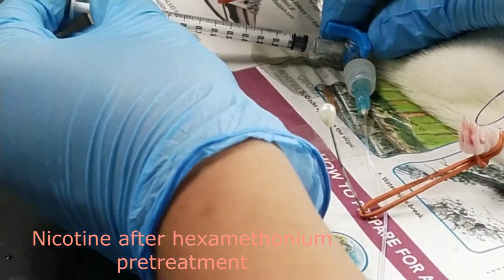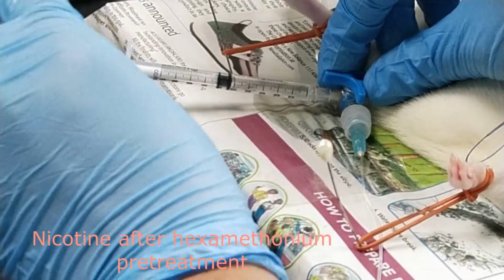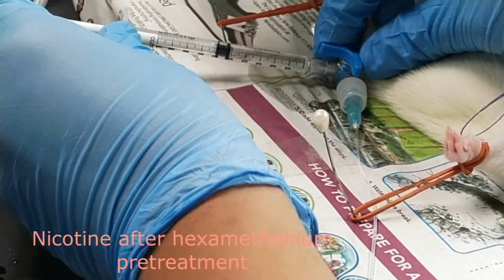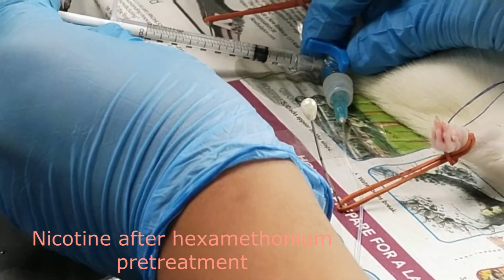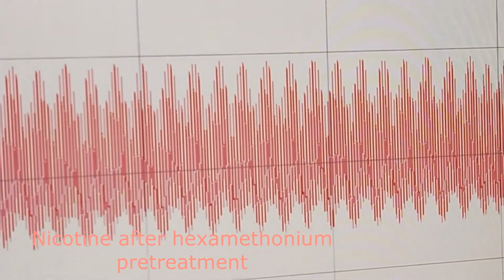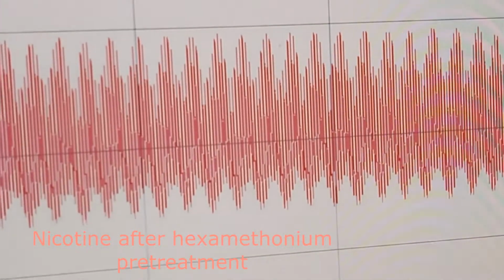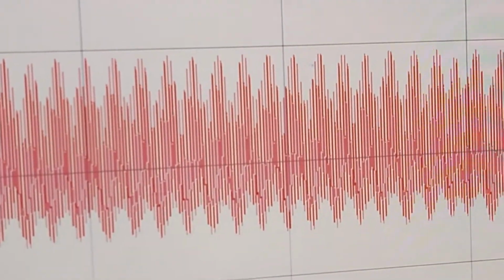Okay, so followed by 0.5 ml of normal saline. So after the post-treatment of nicotine, you can see that there are no changes in terms of blood pressure.